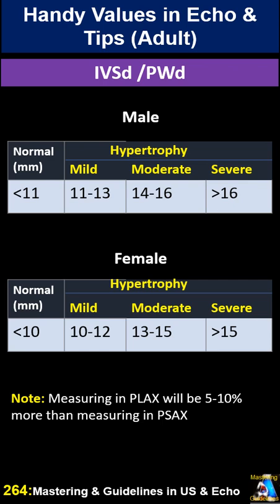Whatever parameter and value you need, just go and find it and click on it, and it goes right away to that parameter. And after each parameter value, I am going to talk a little about those practical points and tips that help you when you do those measurements.